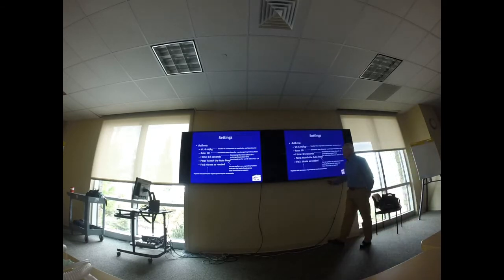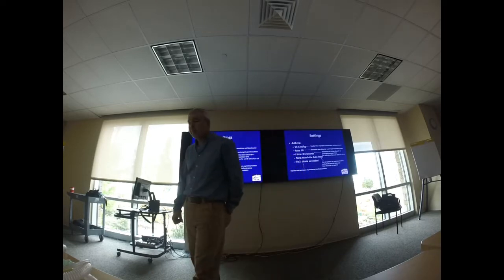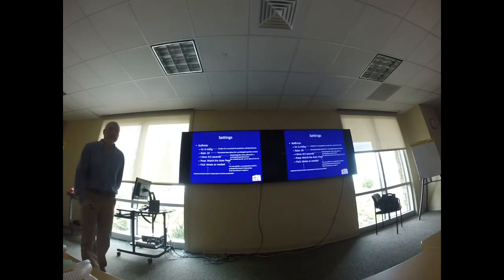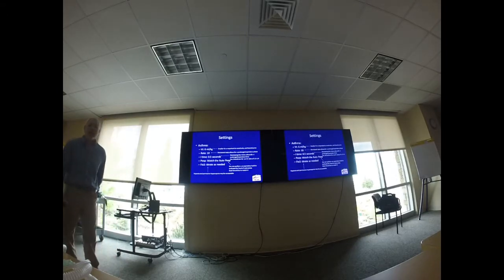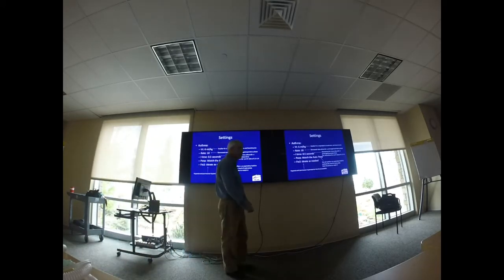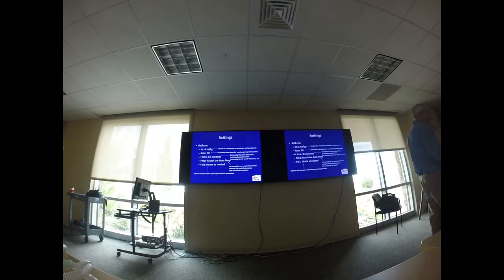And PEEP used to be super controversial. Do you give PEEP? Do you not give PEEP? But probably the best thing to do is try and figure out what your auto PEEP is and match it. So if my auto PEEP is 7, then you give them 7. If your auto PEEP is 10, you give them 10. And hypoxia and permissive hypercapnia may be acceptable. So if my end tidal CO2 is 48 and I'm 84%, I'm probably happy with it.